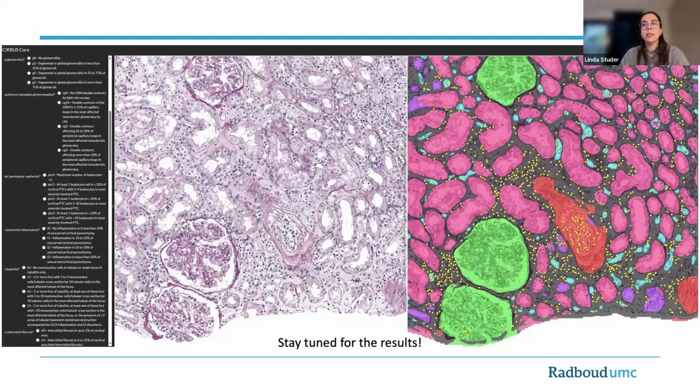I think it often thinks it's something connected, like an adjacent structure, or another type of structure that has a lot of white space. If we had a tighter tissue segmentation, we could definitely alleviate that. But in my experience, the pathologists don't mind too much visually. Of course, it's a problem when you want to do some automated assessment, because if you suddenly have a much larger area for one class that you're evaluating on, that's not what you want.